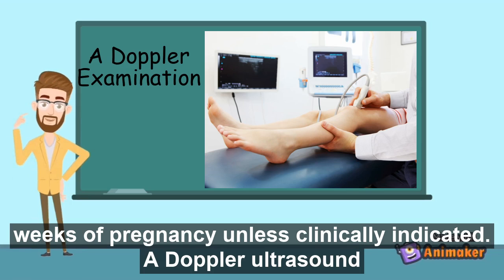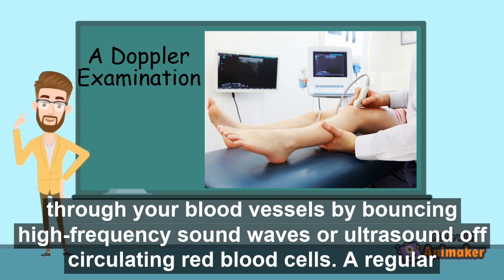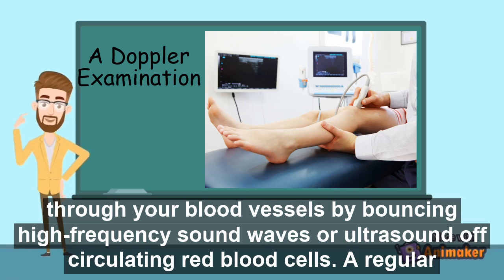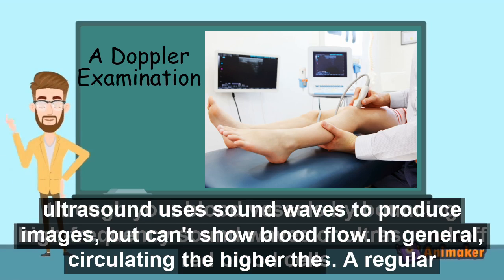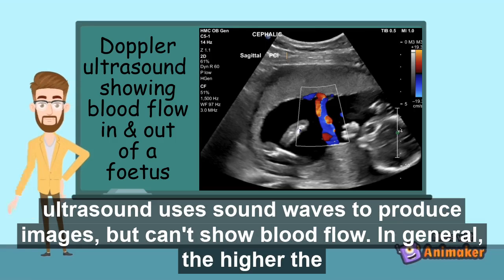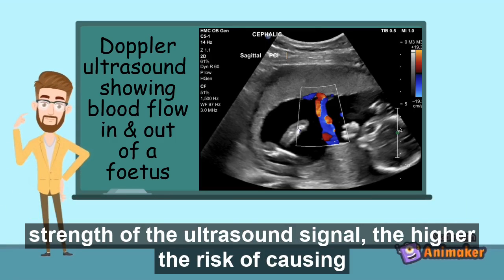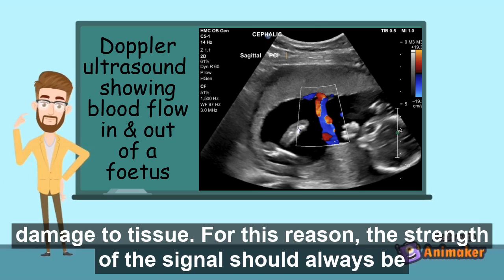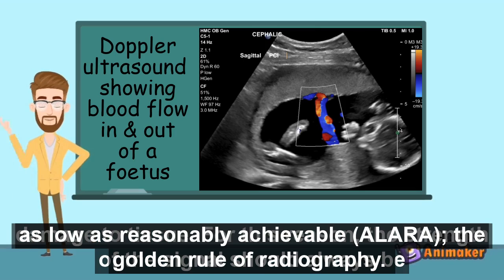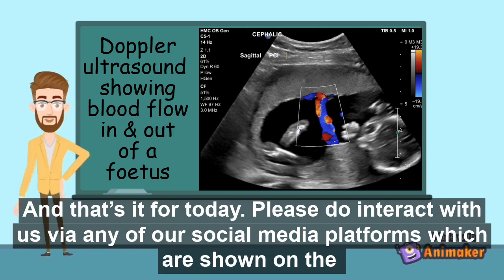A Doppler ultrasound is a non-invasive test that can be used to estimate the blood flow through your blood vessels by bouncing high-frequency sound waves off circulating red blood cells. A regular ultrasound uses sound waves to produce images but cannot show blood flow. In general, the higher the strength of the ultrasound signal, the higher the risk of causing damage to tissue. For this reason, the strength of the signal should always be as low as reasonably achievable — ALARA — the golden rule of radiography. And that's it for today.